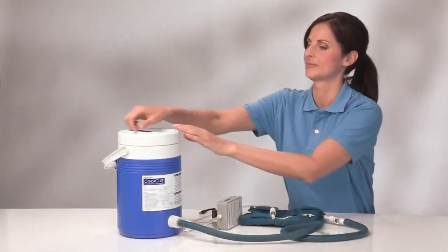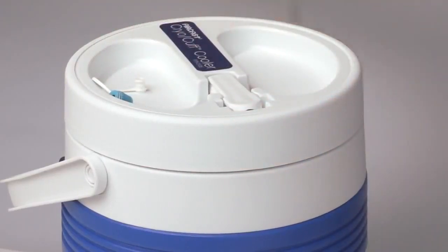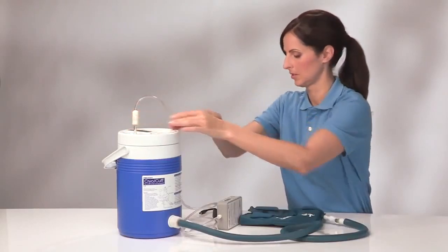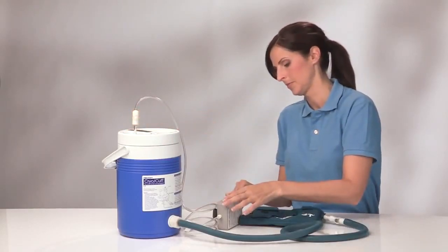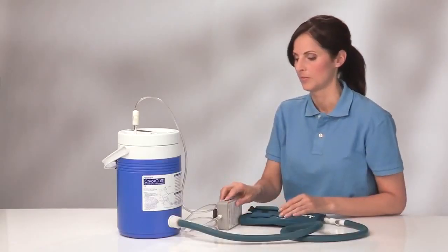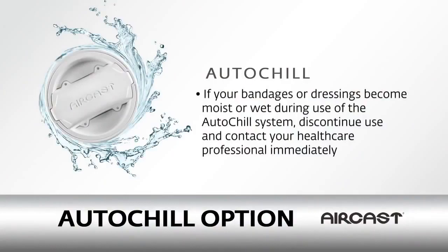Connect the clear air tube from the pump to the cooler lid with the check valve at the cooler end. Then connect the power cord to the bottom of the pump. Now, plug in the wall adapter and set the pump power switch. If your bandages or dressings become moist or wet during use of the auto-chill system, discontinue use and contact your health care professional immediately.